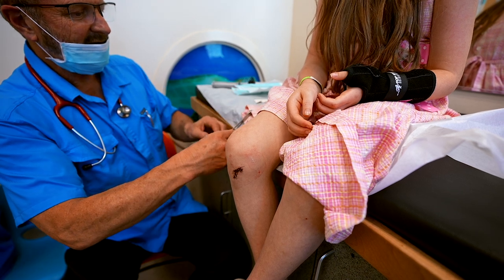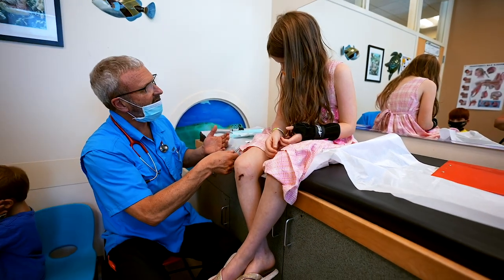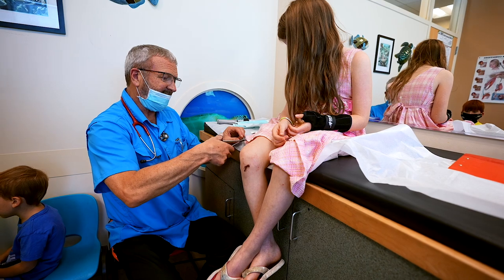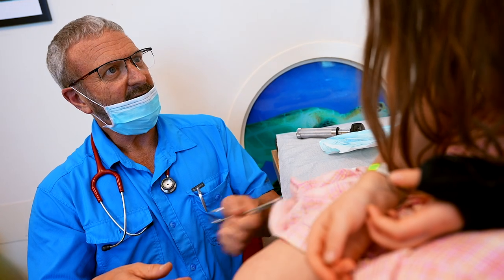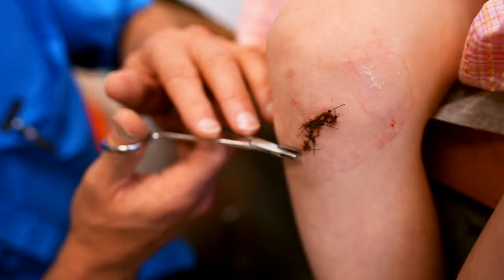Like this. And then I can let go and it won't hurt. But it's just gonna pull just a little bit on your stitch so I can get under it and cut it. But if I've got this on your stitch and you go... you're gonna hurt, cause it's gonna pull on it. So don't touch it, okay? Alright, so we'll start off right here. We'll just stick it on a stitch.